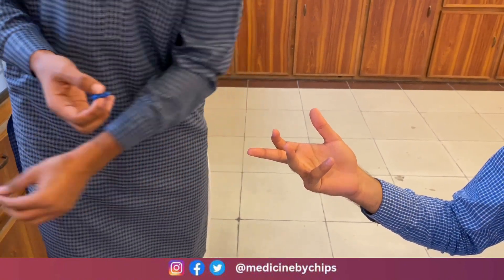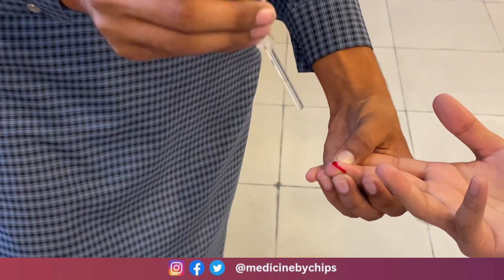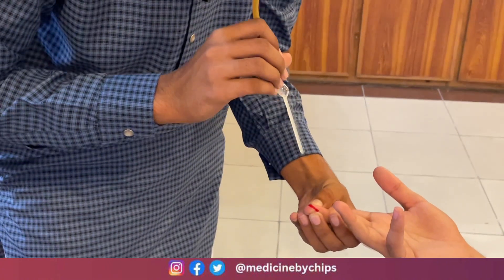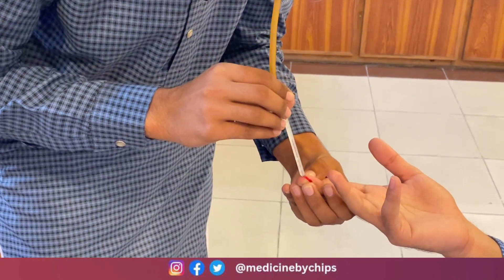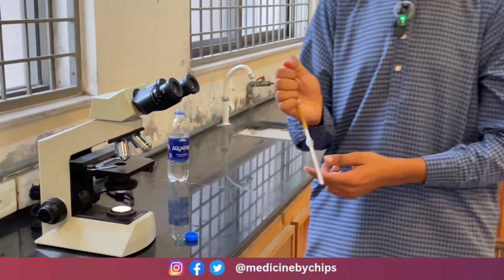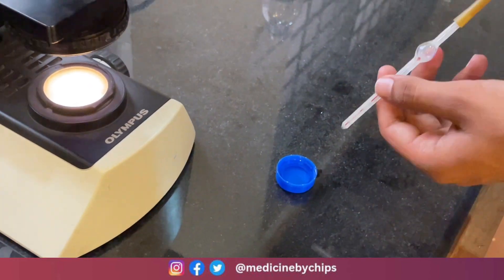Then we will prick the finger with the pricking needle to get blood. We will suck the blood with the RBC pipette, placing it on the blood and sucking it to the 0.5 level. Then we will take Hayem's fluid or the saline and fill it to the 101 level on the RBC pipette.